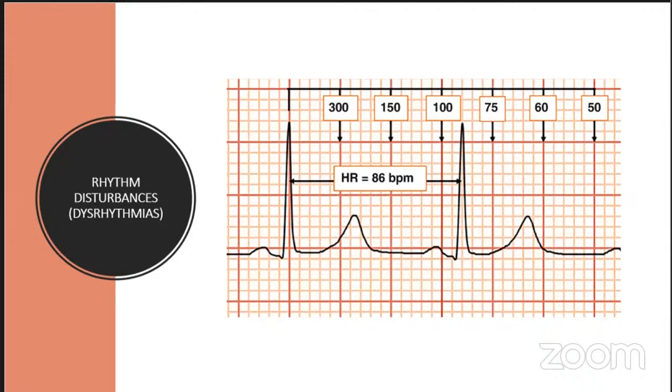Okay, so another thing I would like us to know when tackling ECG questions on the NCLEX would be to determine the heart rate, because if you're able to determine the heart rate, you can actually say if the patient's heart rate is fast or if it is slow. There are different methods to use, and again, it's an estimate.